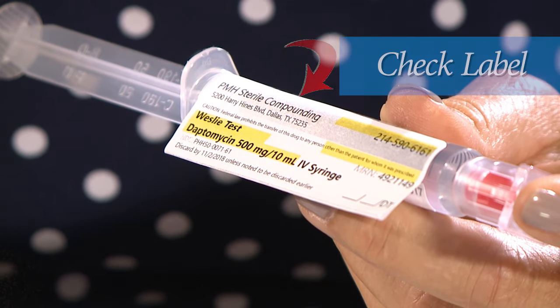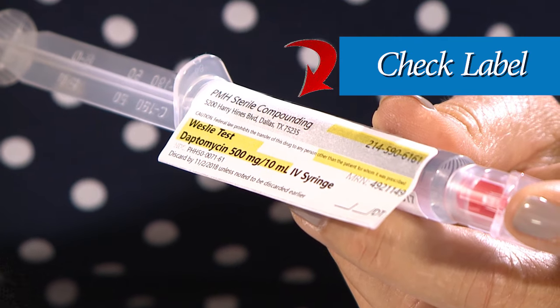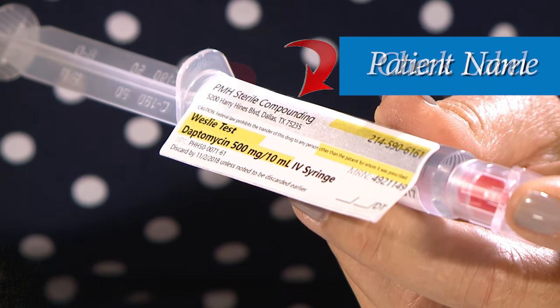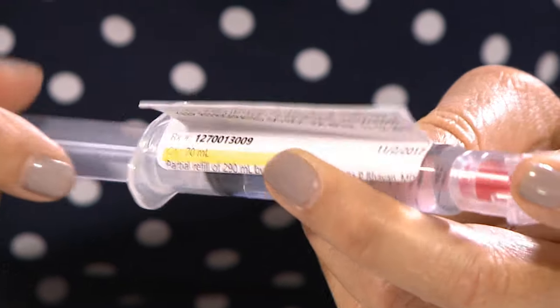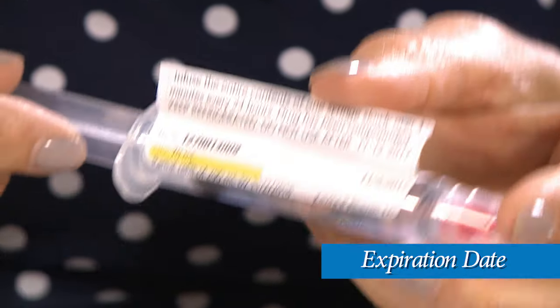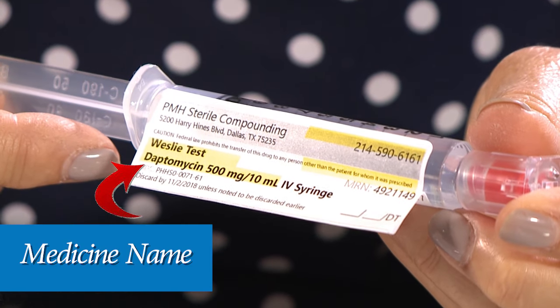Next, carefully look at the label on your IV antibiotic syringe to make sure that it is your medicine. Look to see that it has your name. Next, check that it has not expired — look for the expiration date. And finally, check and see that it is the correct medicine that was ordered by your provider.